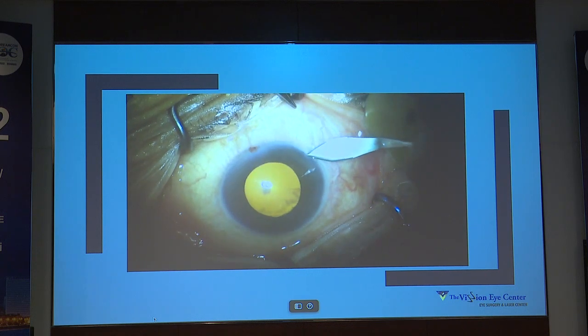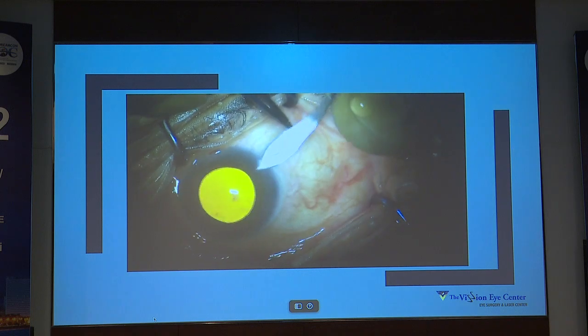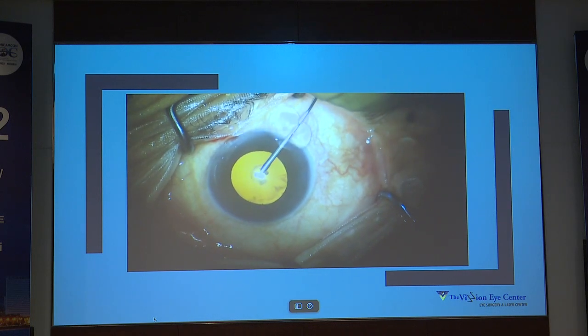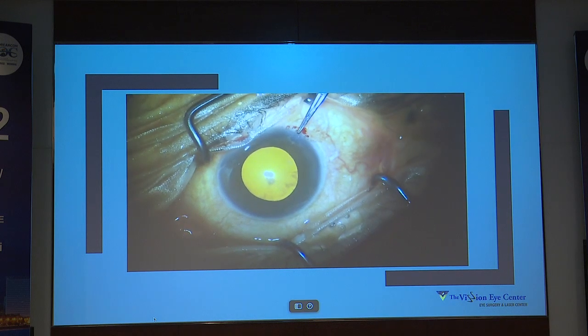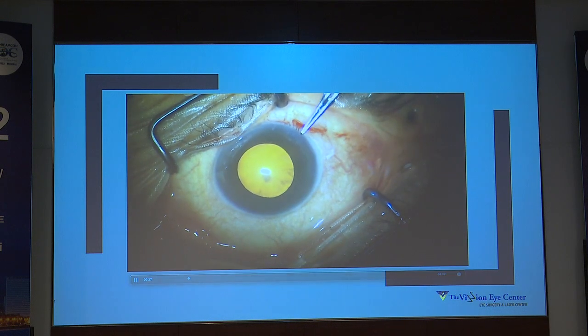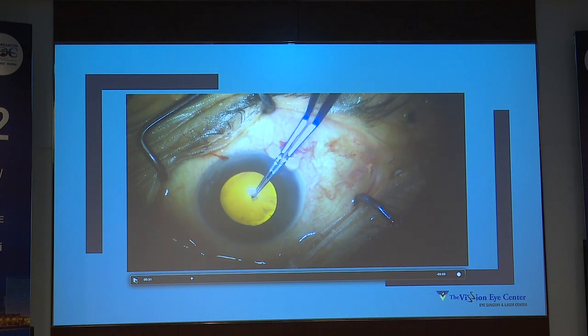So as the incision goes further, try to be a little further away. Hopefully that does not happen. Now look at that again. The moment I get in, the viscoelastic starts walking out again with me. Now I'm trying to get into the wound. Now I'm trying at multiple points of time. Now here is where I could get into trouble.